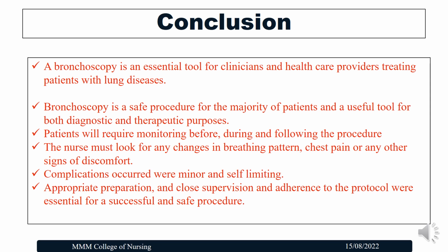Complications will sometimes be minor or self-limiting. So always we should instruct the patient that if they have any discomfort like fever which lasts more than 24 hours, increasing chest pain, difficulty in breathing, or cough more than 2 or 3 days after the procedure, they should immediately visit the clinician or the doctor who is consulting. Appropriate preparation, close supervision and adherence to the protocol are essential for a successful and safe procedure.